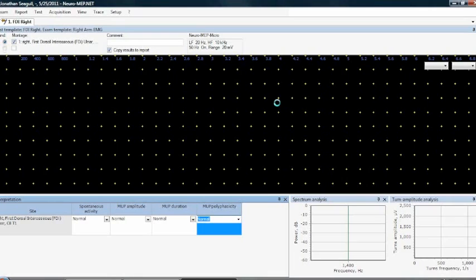In the case of the upper extremity, the next muscle that we do is the flexor carpi radialis. And again, you study the motor unit potential, measure the duration, amplitude, latency, and so forth. And you fill in the information here below so that it goes to your report.